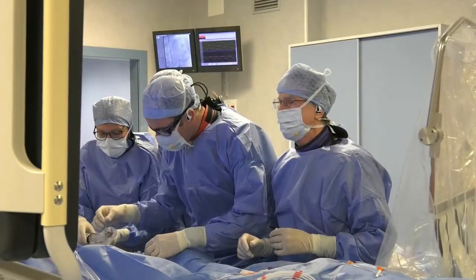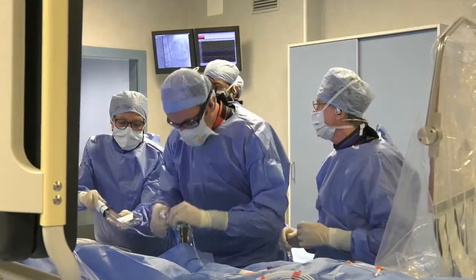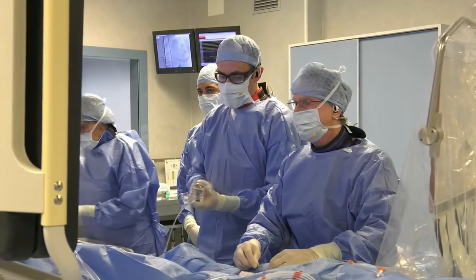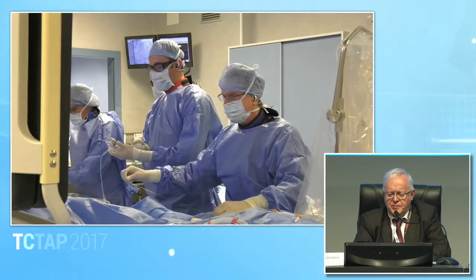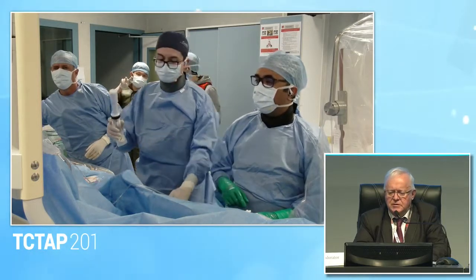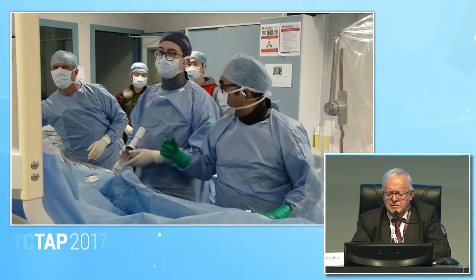while we do a pre-dilatation of this LAD, and maybe we come back here when we are ready to stent. What do you think? It's okay? Yeah, good idea, Antonio. Let's go to 16. We go to see Azim. 16. Okay. Can you go to Dr. Latib, behind, please? Azim, we are with you. Go back, go back. So let me tell you where we've been.